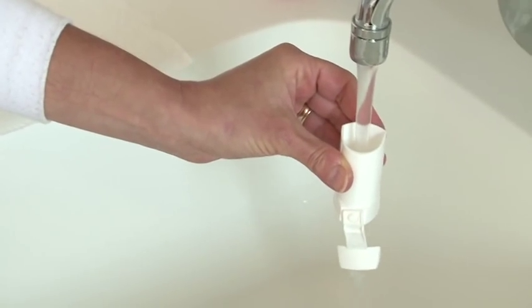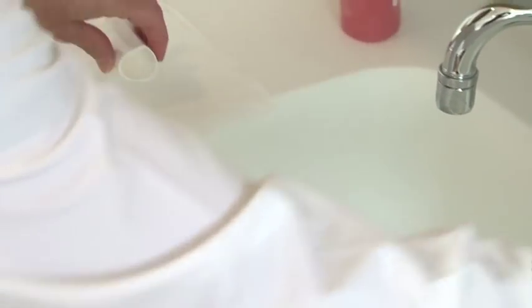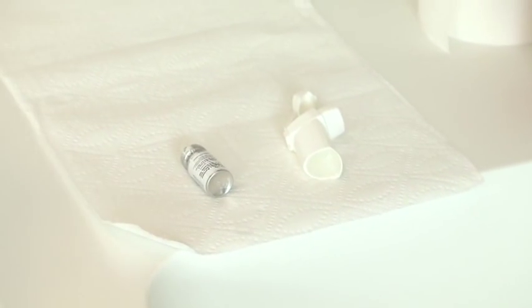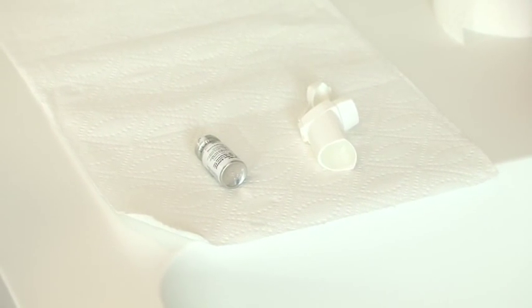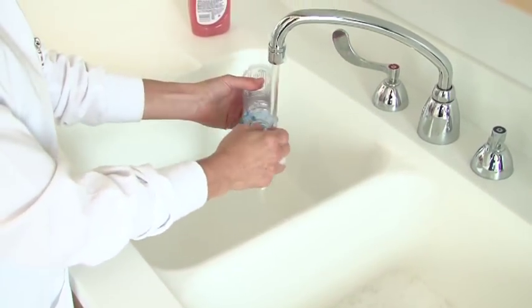Clean the plastic holder of the inhaler each week: run warm water through it, shake off water, and set overnight to dry. Clean the spacer and mask each week by soaking in warm soapy water for 15 minutes and run water through it. Shake off water and set overnight to dry.